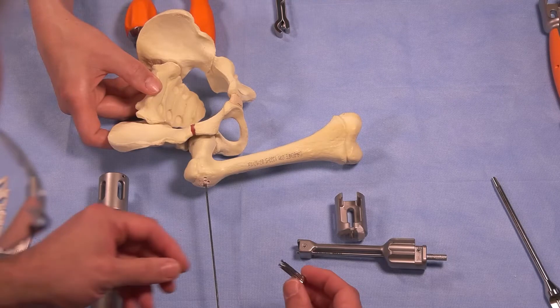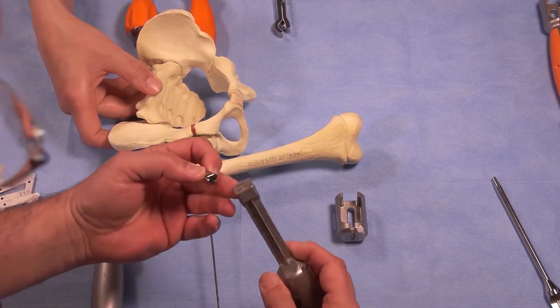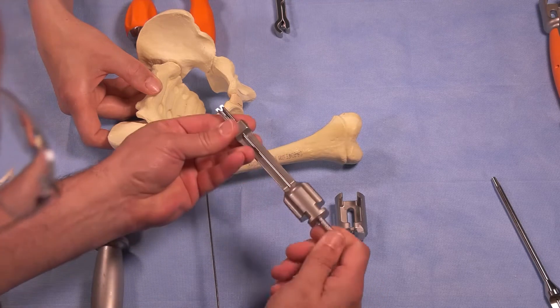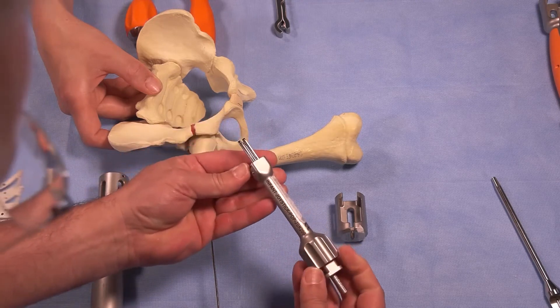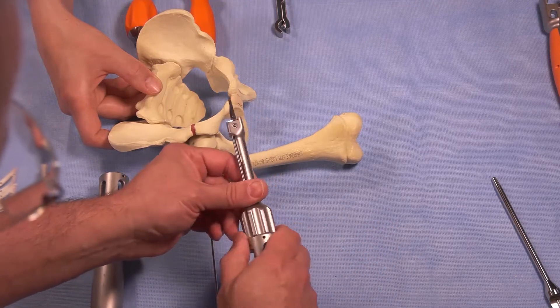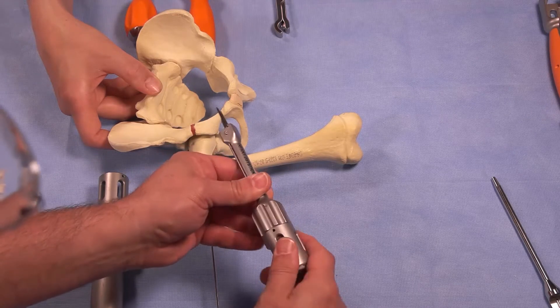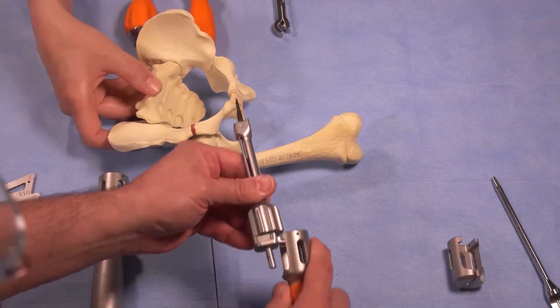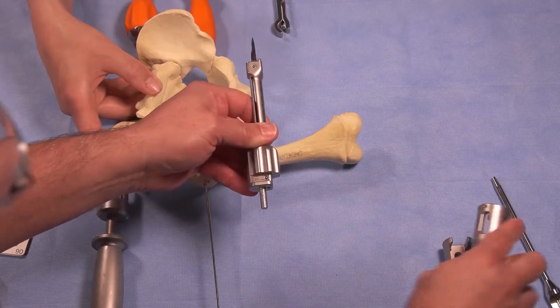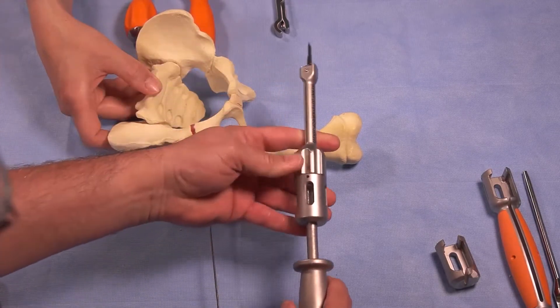To insert the chisel blade, you first attach the chisel blade to the driver — that's simply connected with the threaded portion. Now this is ready to be inserted. You can either put the cap on and strike the end with a mallet, use an extension cap that gives you a longer and slightly heavier handle, or you can place this with a slap hammer.